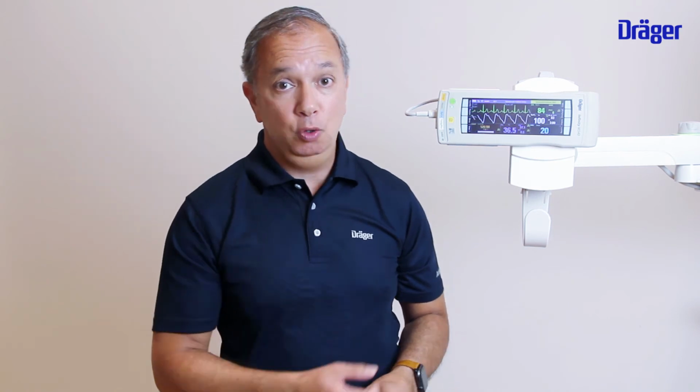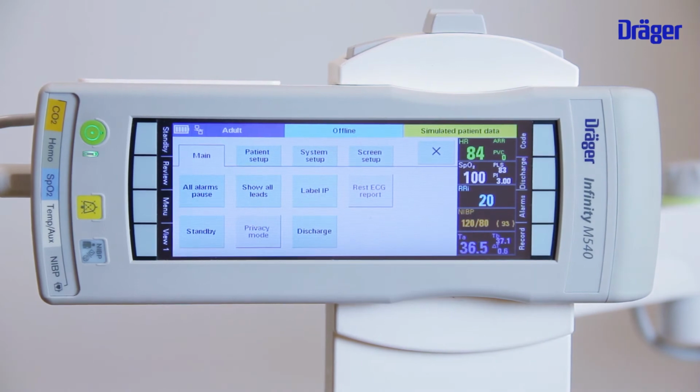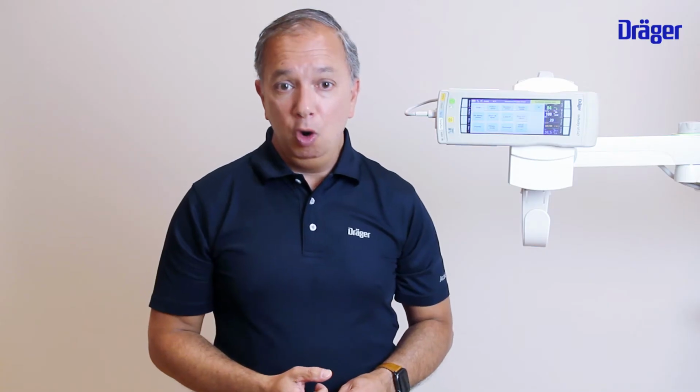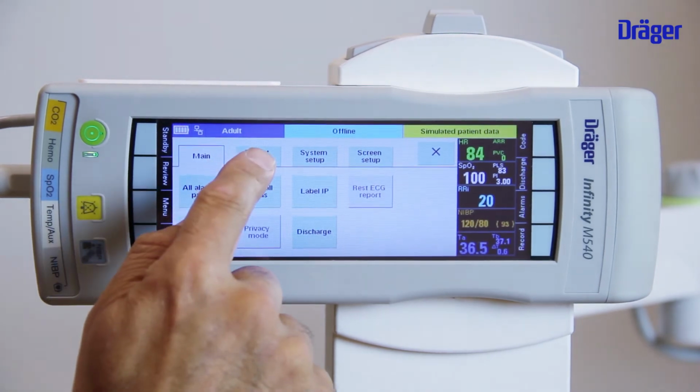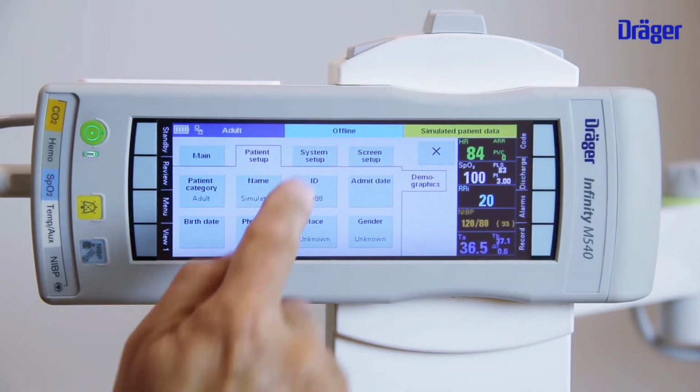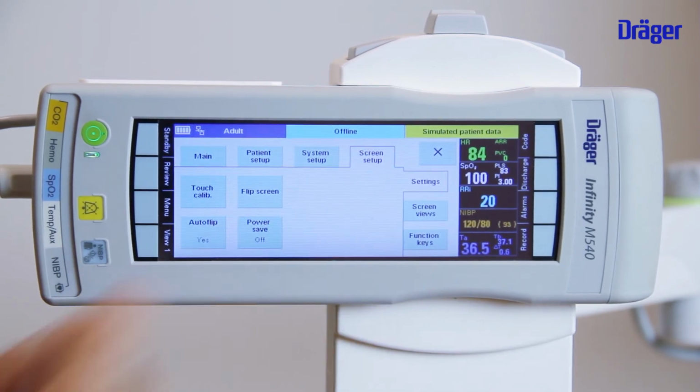I will go through the most important function keys. So the first one is the key menu. It's up to here. When you press menu, 4 tabs will be opened. So the first one is main settings, the second one is patient settings, third one is system settings, and the last one is screen settings.